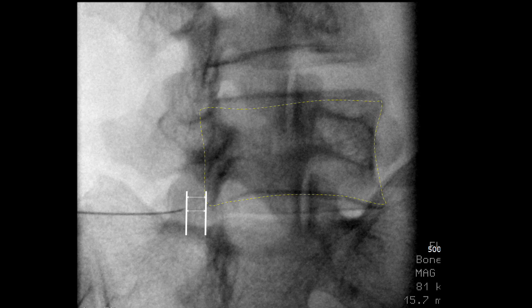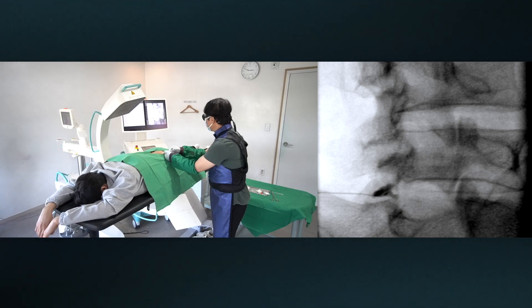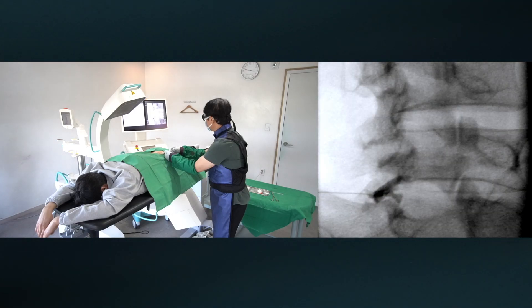If there is severe disc protrusion, the needle may have already punctured the annulus at this point. If you have MRI, please observe the degree of disc protrusion. Otherwise, I would depend on my sense of fingertips. The contrast media would help confirm the correct space, avoid intravascular uptake, and understand the hydrodynamics of the epidural space.